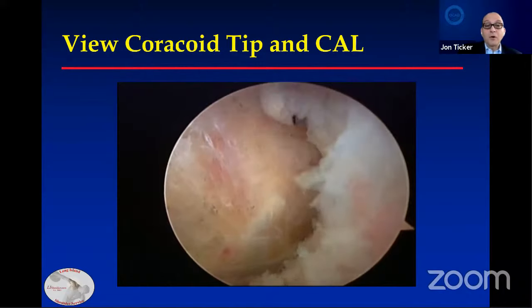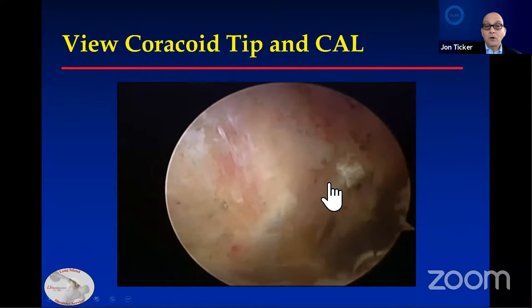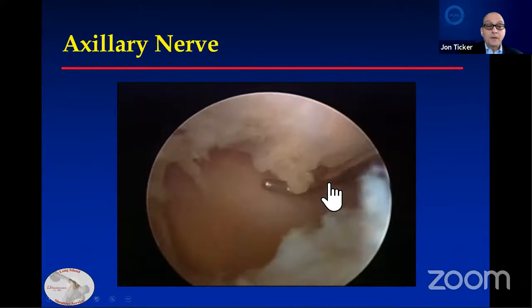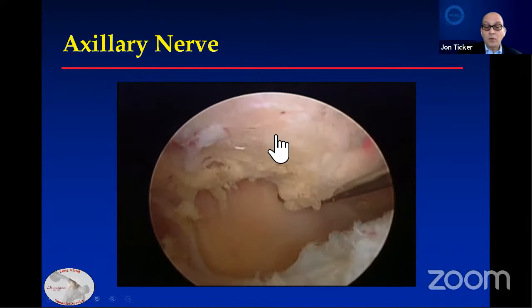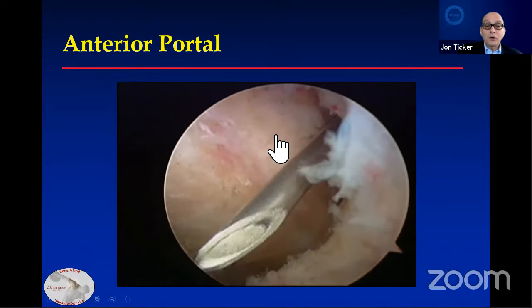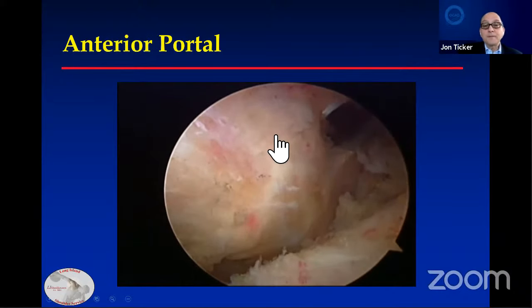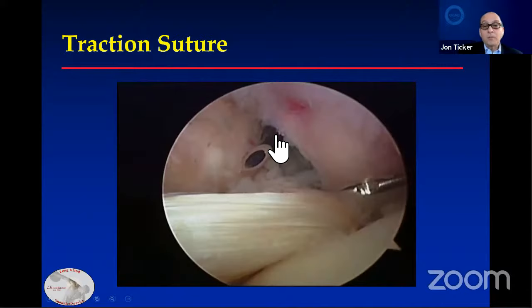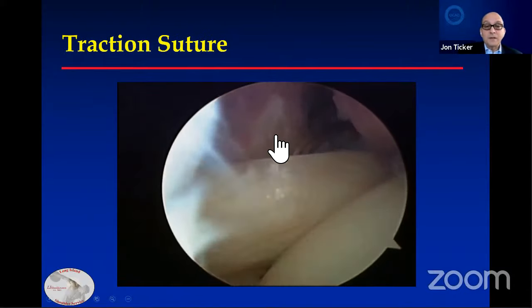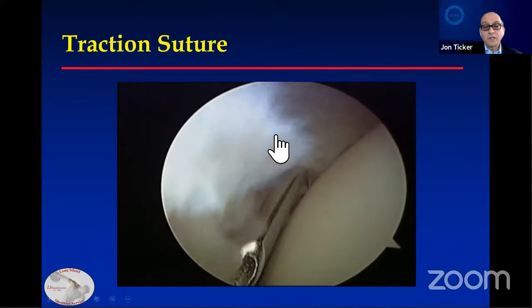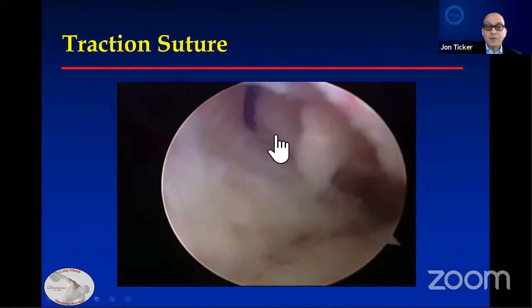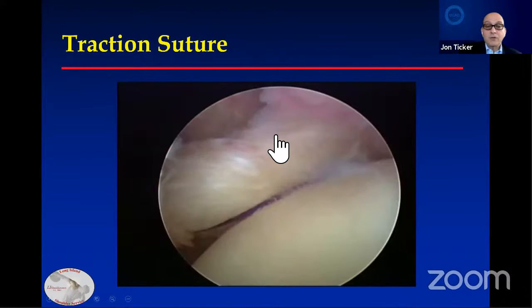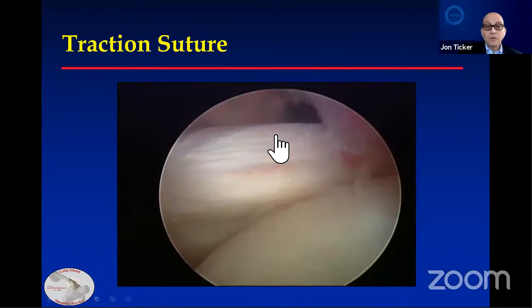This is the area I'm looking for. Here's the coracoid tip and the coracocromial ligament. Sometimes you can identify the axillary nerve — you know it's there; I don't go looking for it. This is the coracoid, looking more medially and inferiorly over the subscapularis. I'll need to approach the tendon and create a cannula. Then I want to put in my traction suture. This is a device that can penetrate through — it's about two to three millimeters in size. I'll feed through a monofilament suture, make a small stab incision laterally, and bring it out so that I can control the tendon.